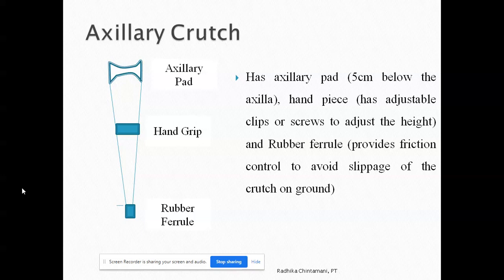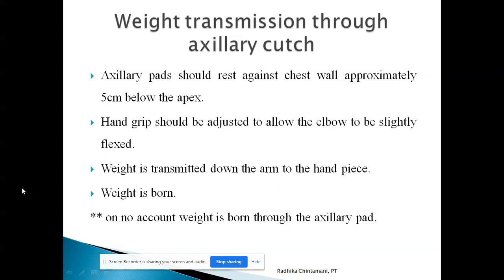The axillary pad is usually placed five centimeters below the axilla to avoid impingement of the brachial plexus, which is present in the axilla. The hand grip has adjustable clips or screws to adjust the height. The lower part is the rubber ferrule, which provides friction control so that slippage during walking is avoided. Both the position of the handpiece and the total length of the crutch are adjustable.